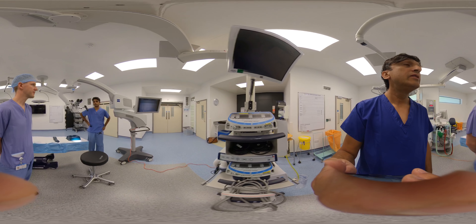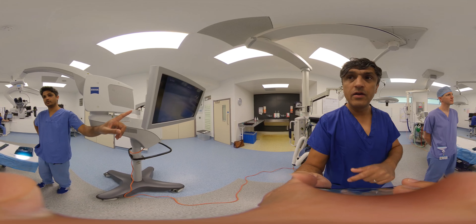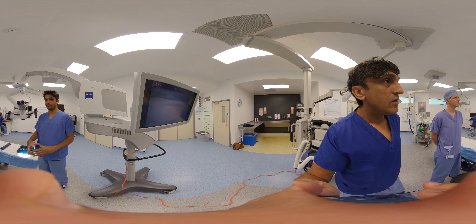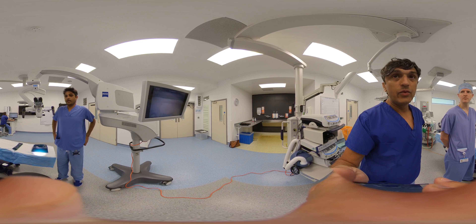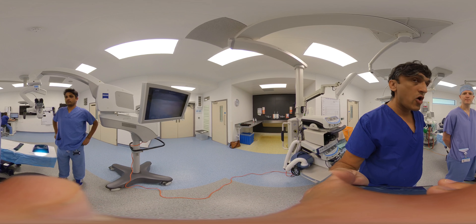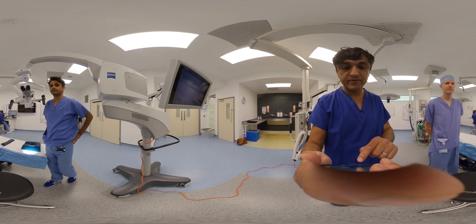A demonstration using the monitor to zoom in and zoom out would be useful. We'll get the simulation vessels for that and overlay the simulation footage over this video as well.